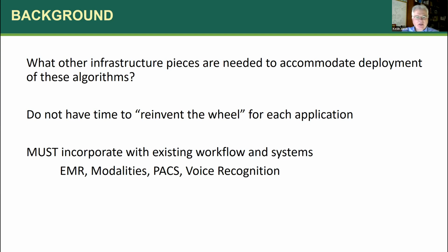We've got the modalities themselves. We've got PACS, voice recognition. You may have some type of workflow management software in your institution that helps guide what's the next exam to read, or that may be rolled into your PACS. You know, different places do things slightly differently. But whatever your current workflow is today, how is this new application going to fit into it? It's got to work seamlessly with your existing systems. And that's a big part of what we're going to talk about today.